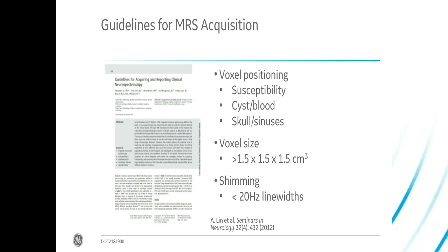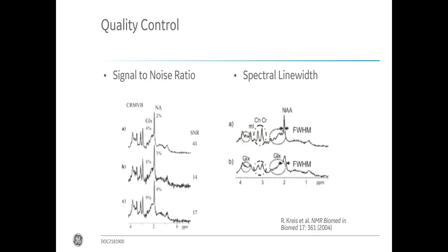And with that, it's also the quality control that you can do for yourself, and there is also a very good publication done by Roland Kreis a longer time ago, where he is looking into how a good spectrum looks, looking at reproducibility of the results.